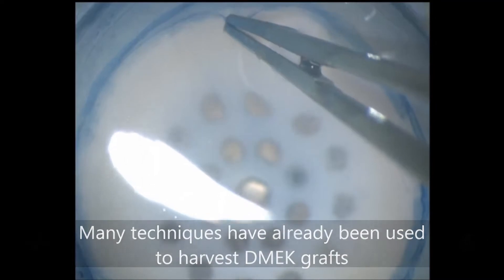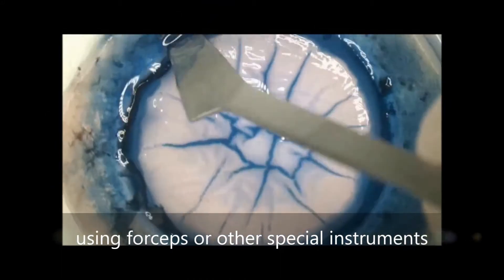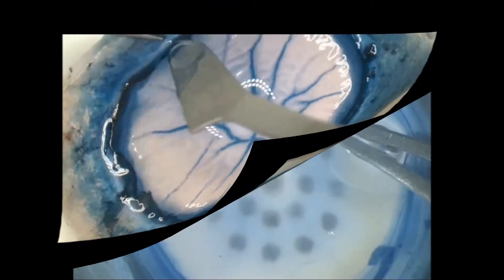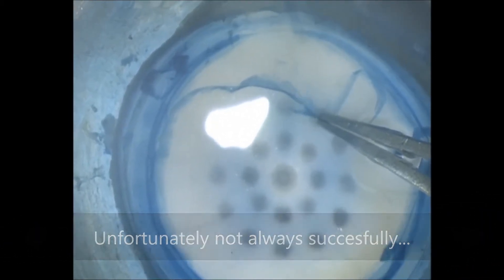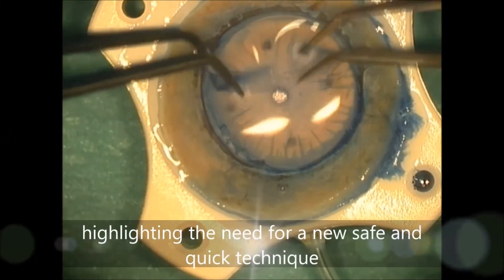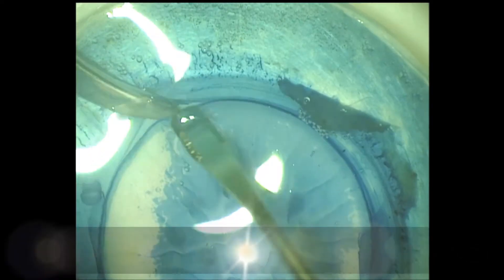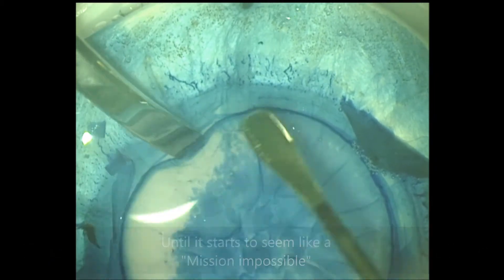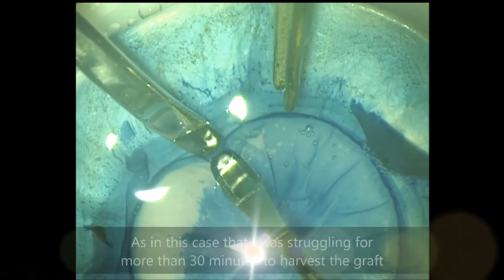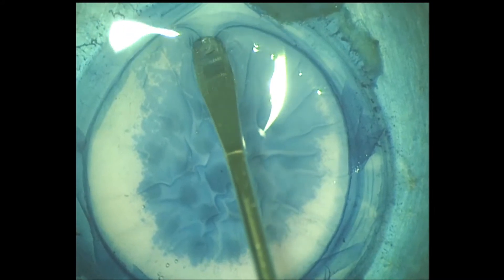Many techniques have already been used to harvest DMEK grafts using forceps or other special instruments — unfortunately, not always successfully. Most corneal surgeons have faced this problem trying hard to detach the DMEK graft from the underlying stroma, until it starts to seem like a mission impossible — as in this case where I was struggling for more than 30 minutes to harvest the graft, not successfully.